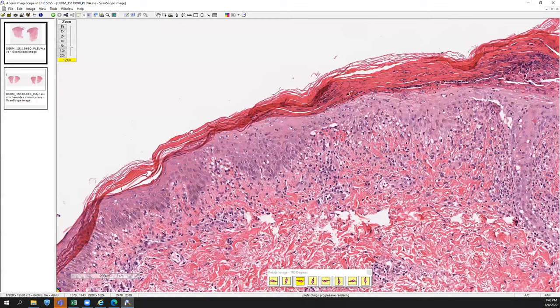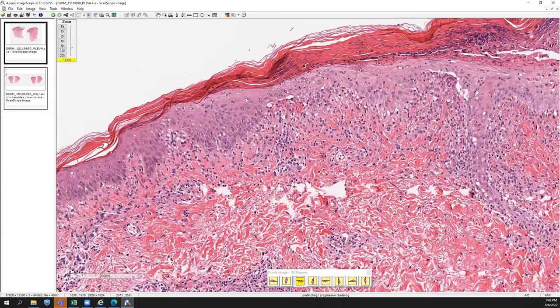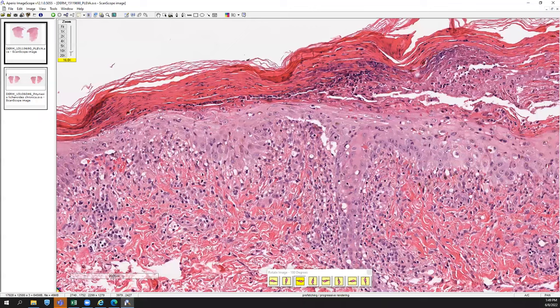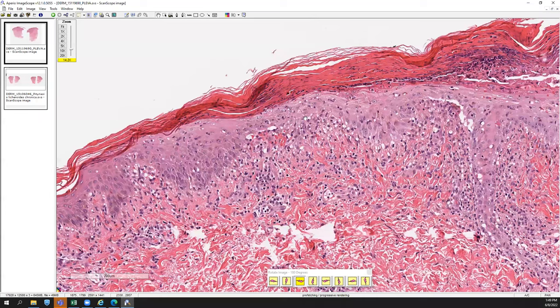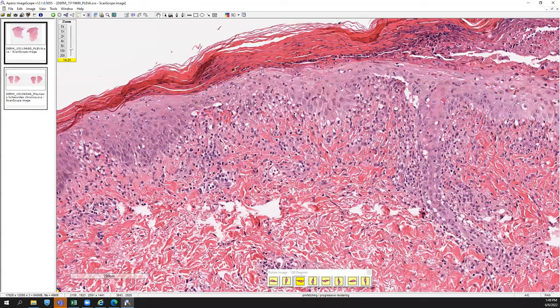Adjacent stratum corneum transitions into a basket-weave stratum corneum. The epidermis also contains scattered apoptotic or dyskeratotic cells, as you can appreciate here with this homogenous pink cytoplasm. There's also a very nice vacuolar interface change here, and underlying that even more so is a mild to moderate lymphocytic, almost band-like infiltrate going in parallel to the basement membrane.